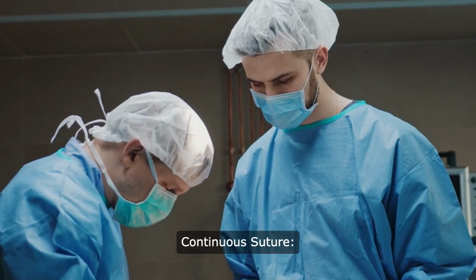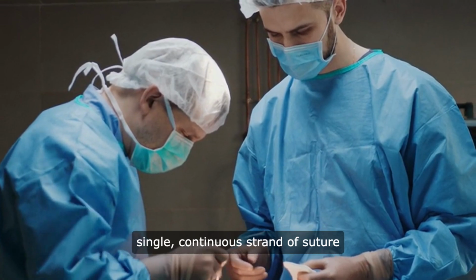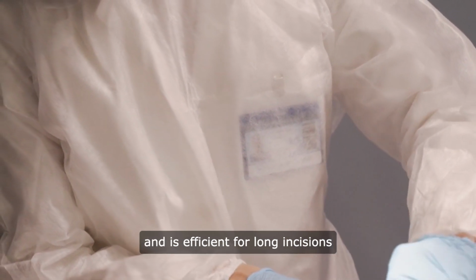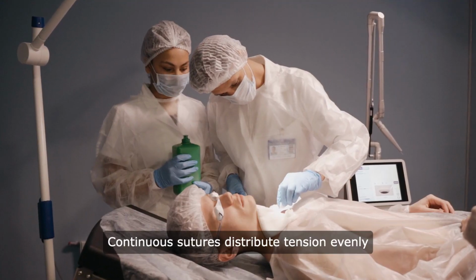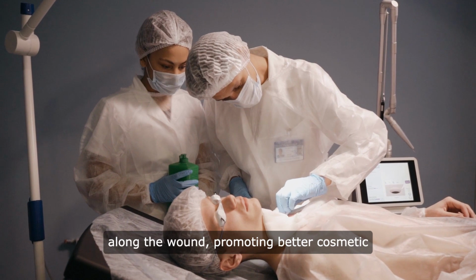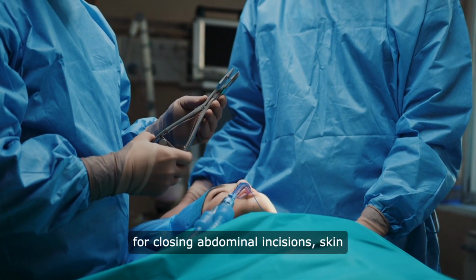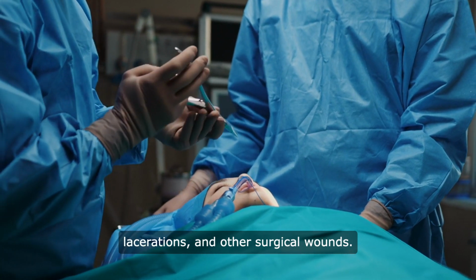2. Continuous suture. Continuous sutures involve a single, continuous strand of suture material used to close the wound in a running fashion. This technique provides rapid closure and is efficient for long incisions or areas with minimal tension. Continuous sutures distribute tension evenly along the wound, promoting better cosmetic outcomes and reducing the risk of tissue ischemia. Surgeons often use continuous sutures for closing abdominal incisions, skin lacerations, and other surgical wounds.